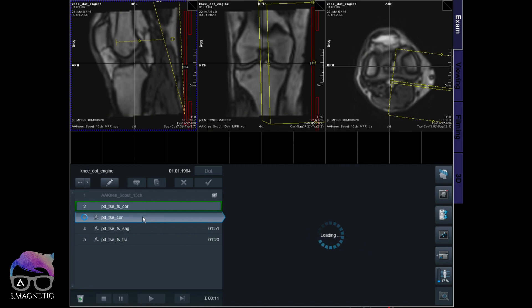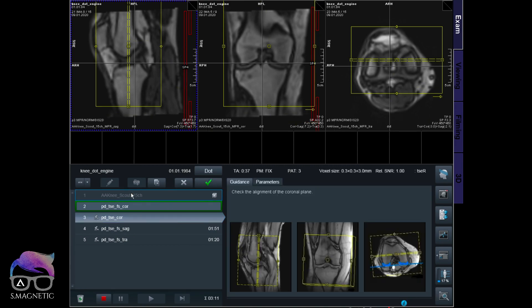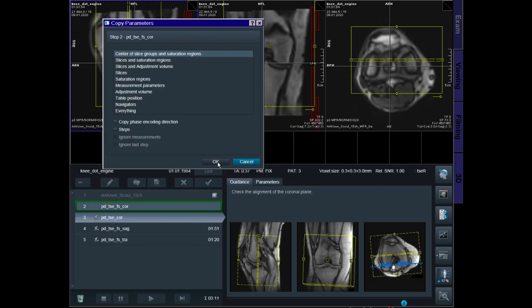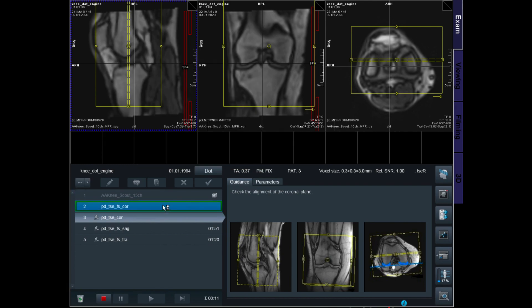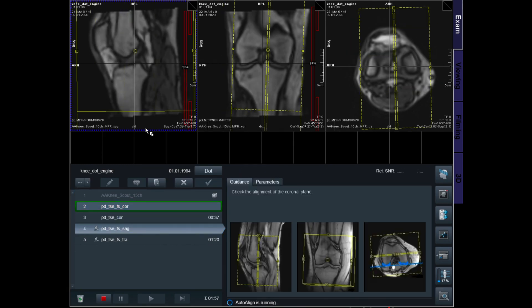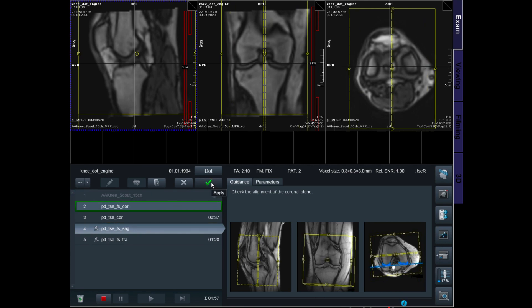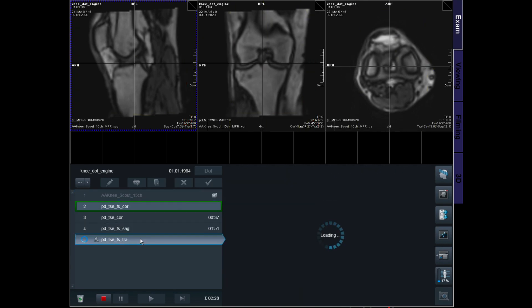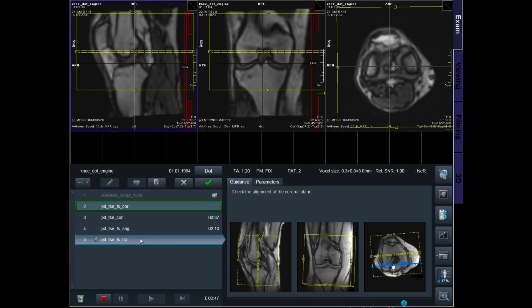For the coronal plane I can copy the slice positioning and just apply. For the sagittal, you see it is auto positioning — I just check and apply. For the transverse positions as well, check and apply. See this extremely fast auto positioning — it will be extremely efficient, consistent, and fast.